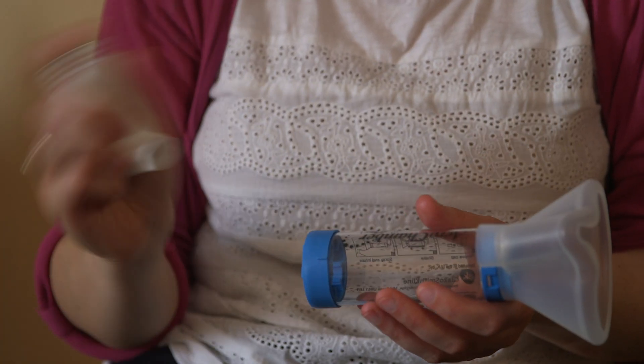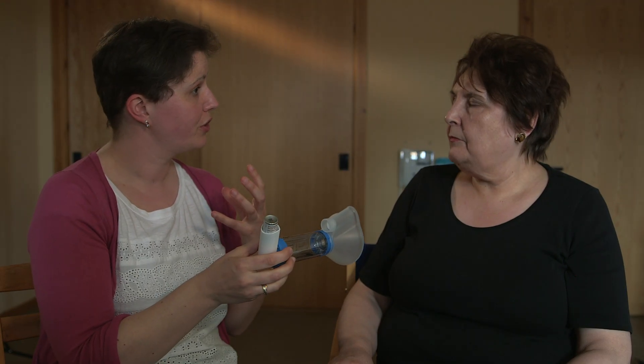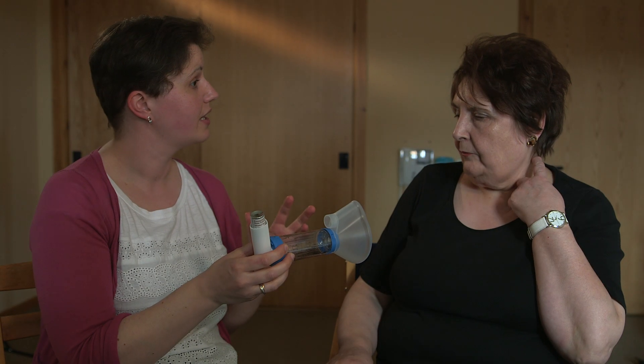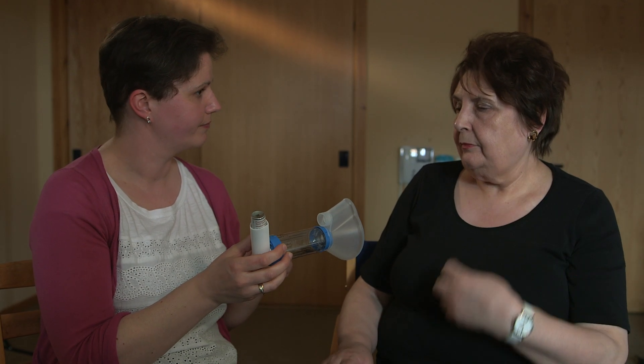Now we're ready to give you your inhaler. Just give it a shake and put it in. Now all I'm going to do is put the mask over your face and I just want you to keep breathing normally through it. I'll put a puff of the inhaler into the spacer and I'll count five breaths and then I'll take it away. So put the mask over your nose and your mouth and breathe in and out normally.